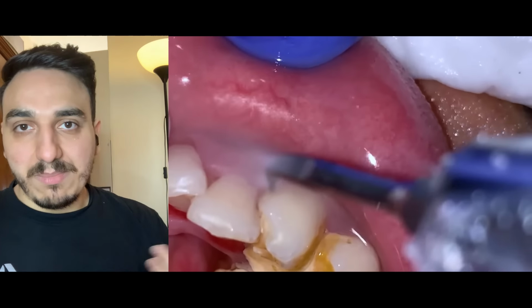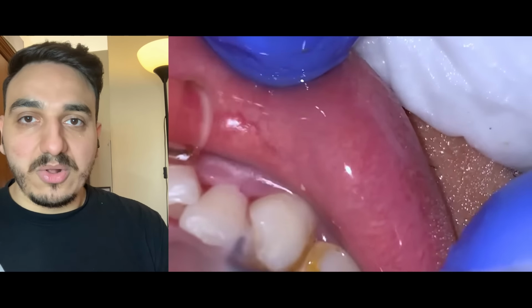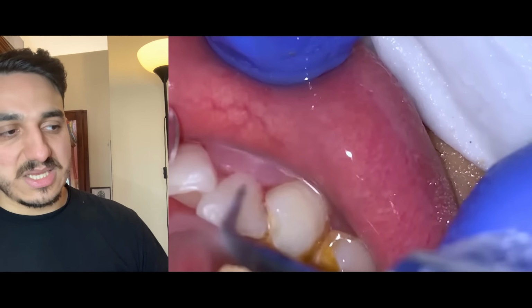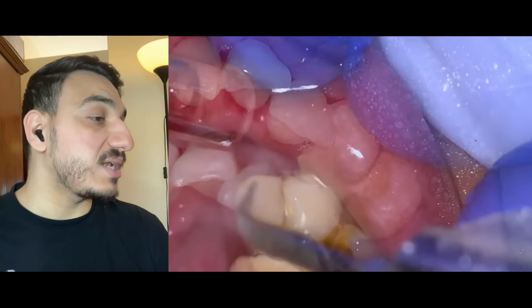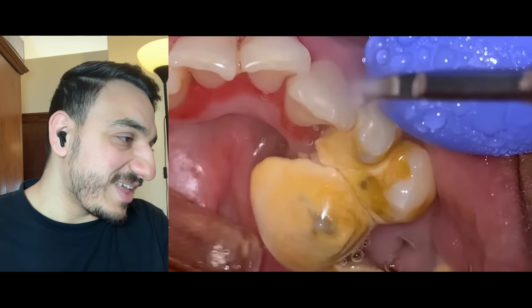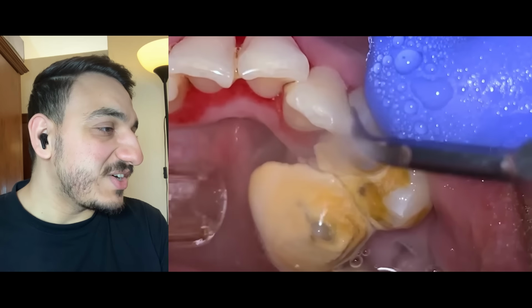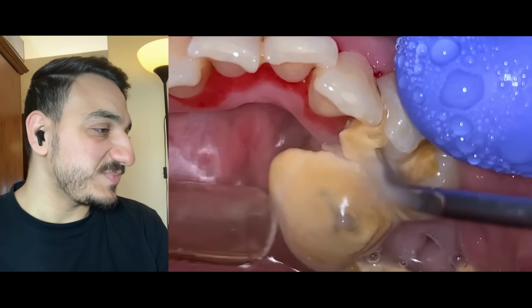Because I worked with a periodontist, who sees cases like this probably every day, this is technically an advanced case of dental tartar and calculus accumulation. The operator takes a breath before moving into that region, trying to remove these pieces of dental calculus.